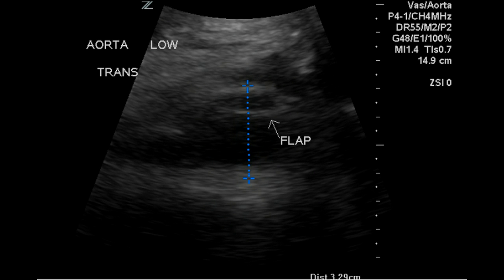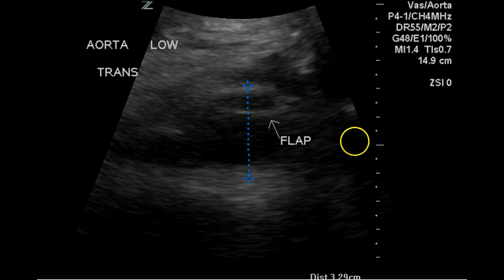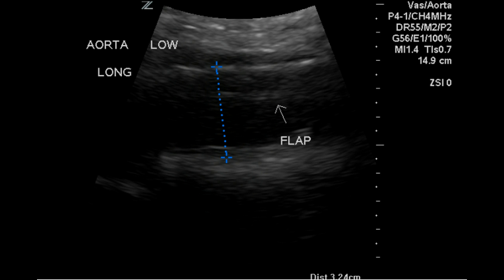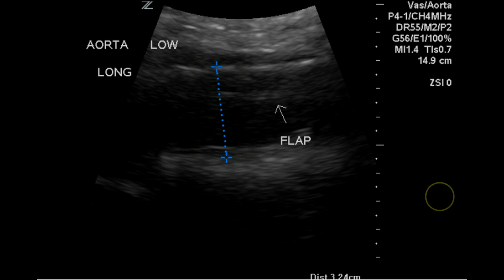Transverse imaging of the distal aorta demonstrated an echogenic flap at some distance from the arterial wall of the aorta. The longitudinal image again demonstrates the flap. The AP measurement is 3.24 centimeters.